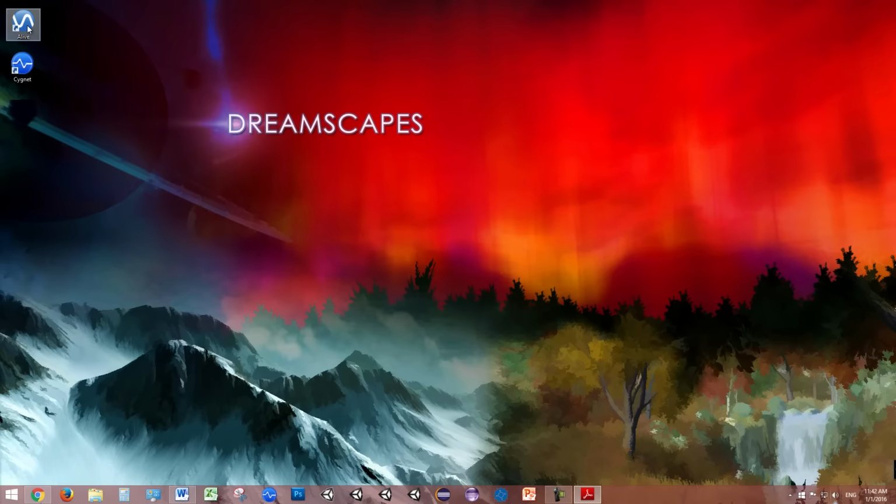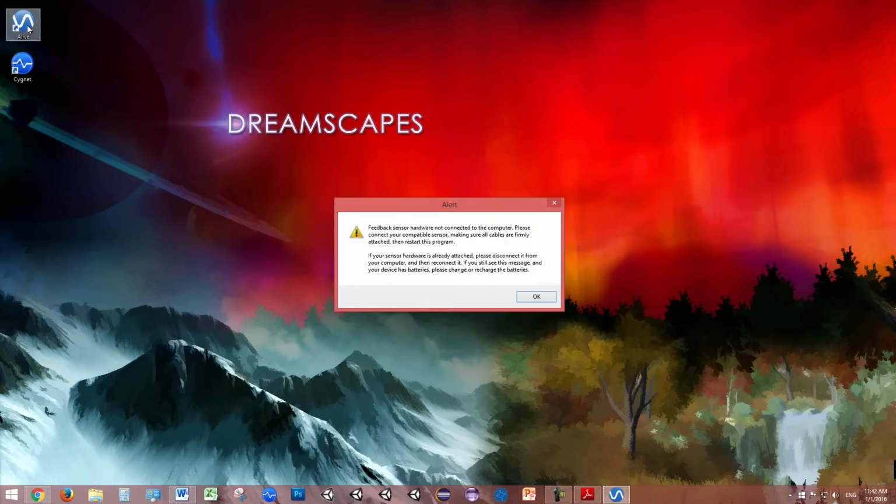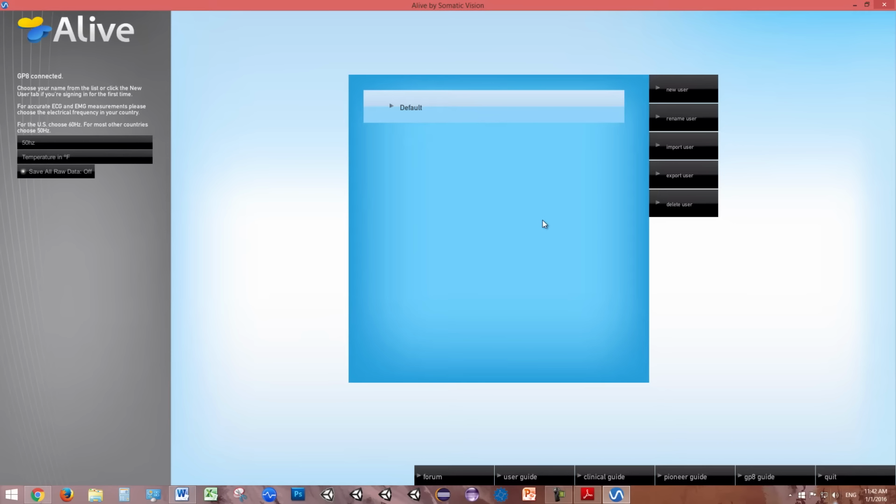When you open Alive, if you see this message, disconnect and reconnect the GP8 amp, then reopen Alive. If your GP8 amp uses batteries, replace or adjust the GP8 amp batteries. Battery life is around 100 hours. Once Alive is open, choose or create a user.